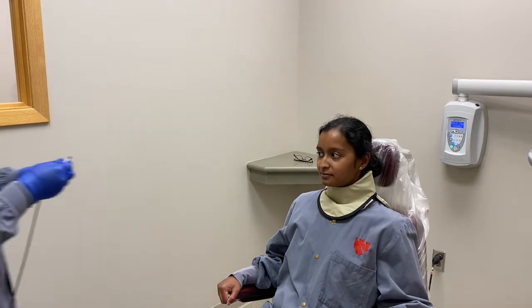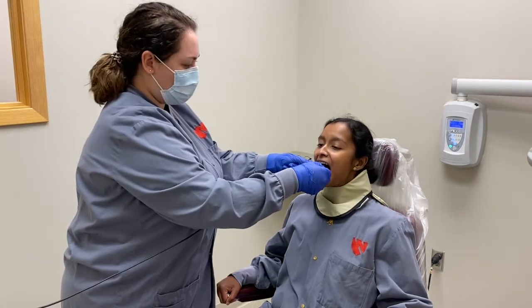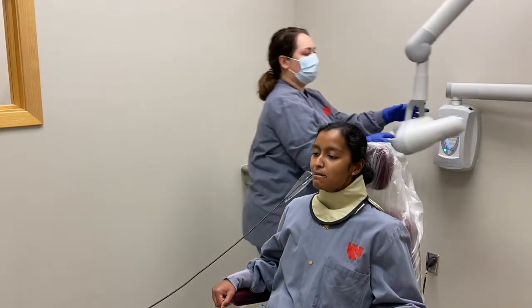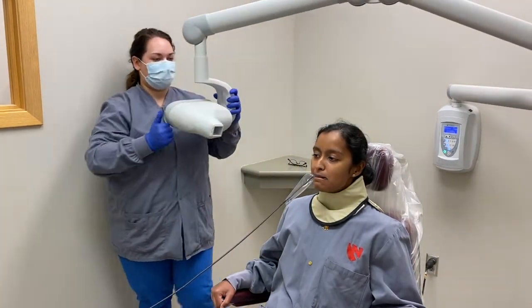Position the patient with the mandibular arch parallel to the floor. The receptor is placed into the mouth with the white side facing down on the mandible and the long edge in a side-to-side direction. The patient is asked to gently bite down on the receptor in an end-to-end bite.